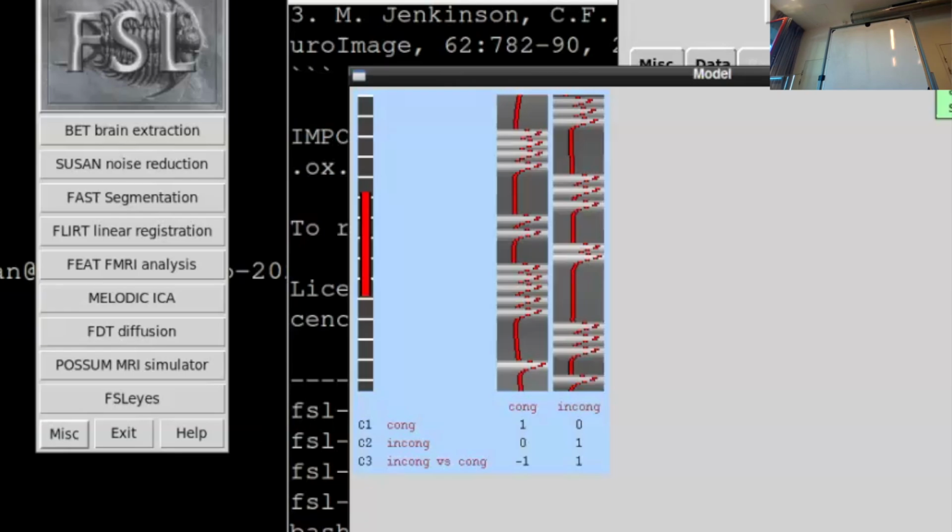So that is what you observe. This is congruent and incongruent. What you see is convolved by the HRF, which is why you see an increase and a decrease. So try to model the perfect signal based on your behavioral data. If the brain was perfect, or life was perfect, you should follow this kind of thing for congruent and incongruent. So you will try to correlate this signal with both signals, and you will find every voxel that is statistically significantly correlated with that. So that's the experiment on the front.